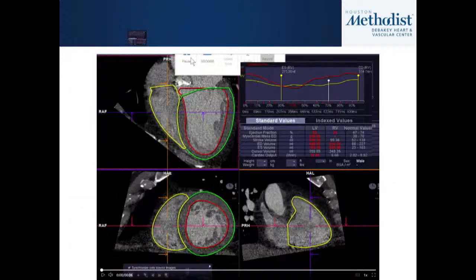Okay, and this is a CT. As you can see, it's not a perfect study because the contrast is not to the degree we like, but this EF is very reliable. You can get RV, LV, EF. So this CT is useful in this situation, all right? When echo gives you an equivocal result, you just confirm that. You can always get MRI, but if you need to go to the CT already, this information is important, okay?